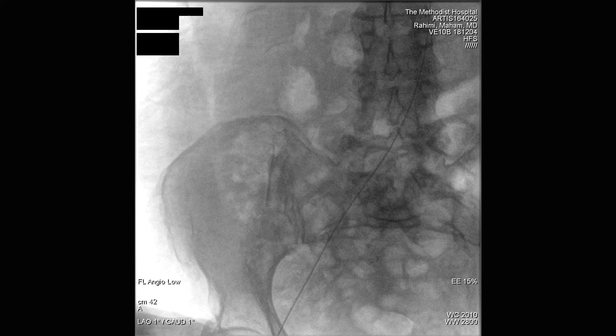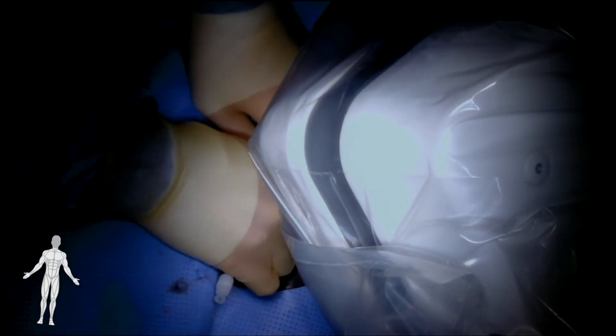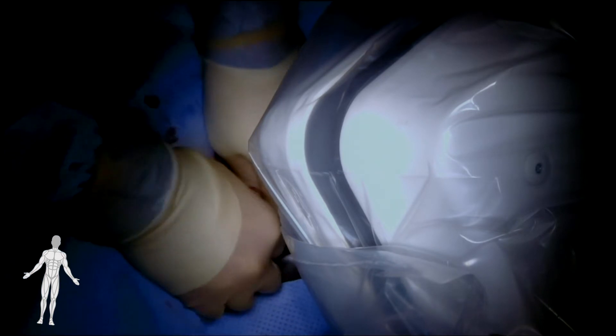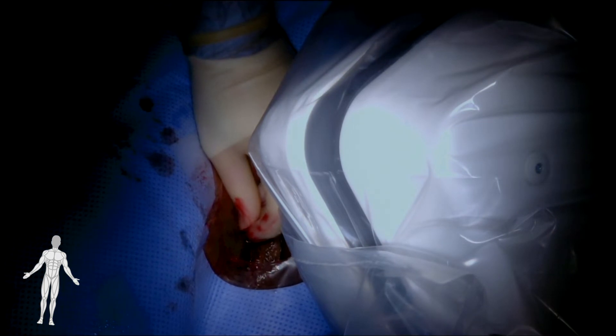After the wire is successfully advanced into the vessel, the fluoroscopy unit — in this case a Siemens Artis Vino — is brought into the field to confirm wire placement into the abdominal aorta. At this point, the 5 French dilator and sheath from the microintroducer kit are advanced over the .018 wire. Once the 5 French sheath is in place, the .018 wire and the dilator are removed in exchange for a .035 Benson wire for access into the contralateral lower extremity.